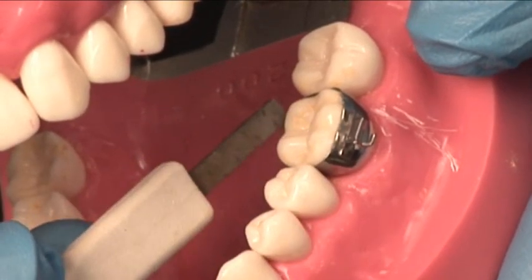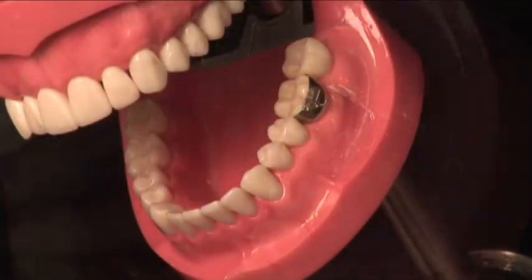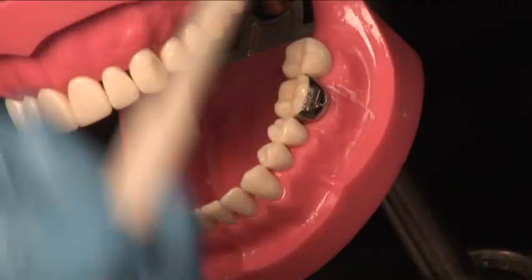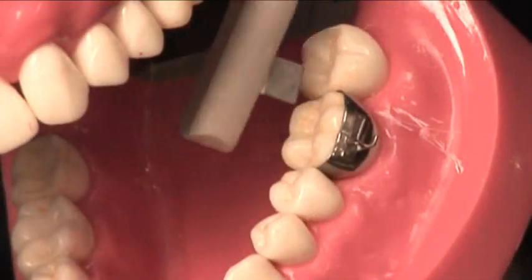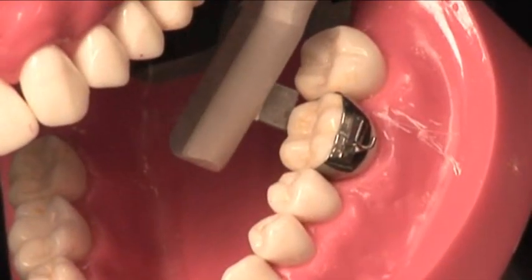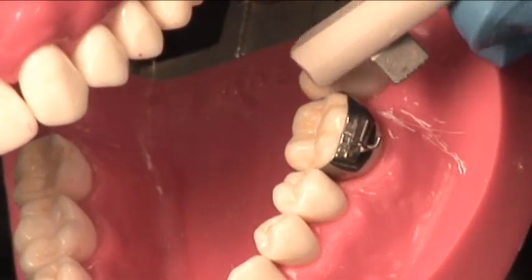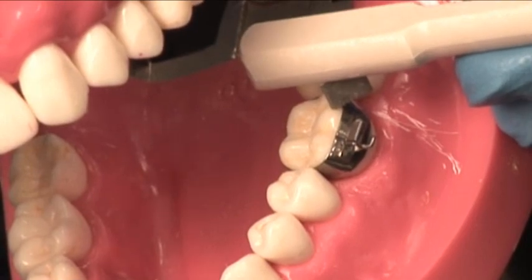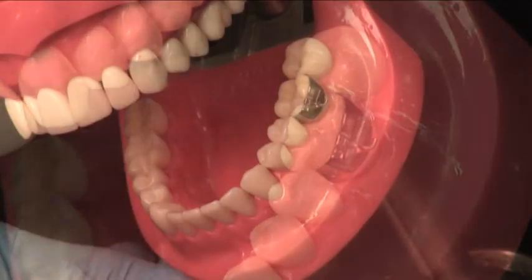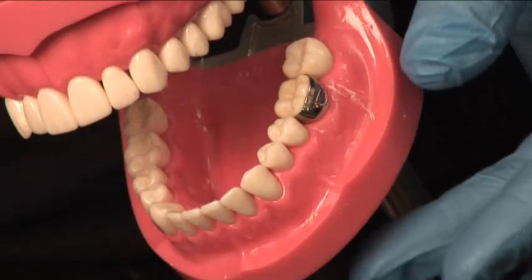Once I get the band down on the tooth where I want it, if you want to, you can use the bite stick. Put it on the inside or the outside, have the patient bite down on the bite stick, and that will give you a little bit more force without slipping.